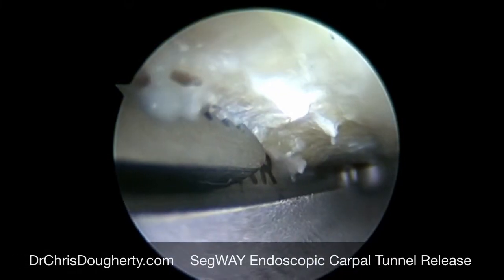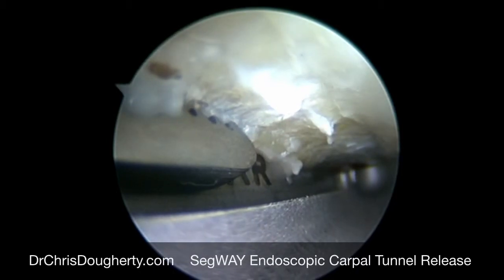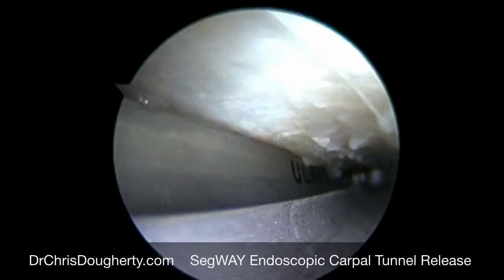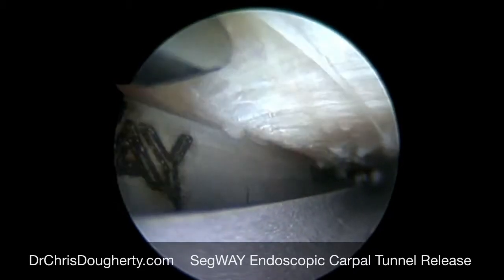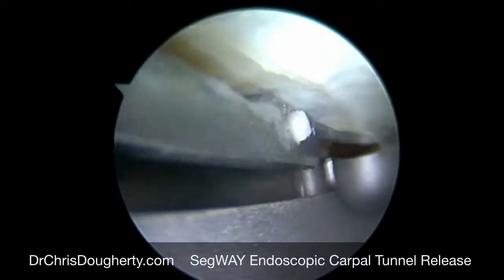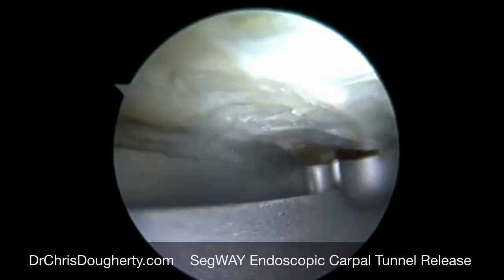This video shows a Segway endoscopic carpal tunnel system. Here we've placed a guide through a small incision above the wrist, underneath the ligament itself. The transverse carpal ligament is typically the main problem with carpal tunnel syndrome, as it gets too thick and essentially squeezes down on the nerve, causing numbness in the fingers.